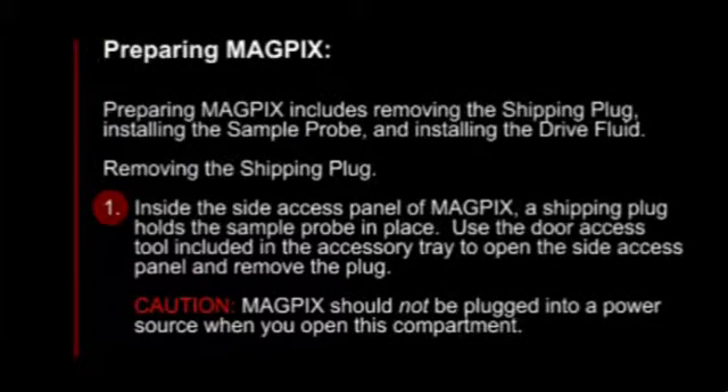Preparing MagPix includes removing the shipping plug, installing the sample probe, and installing the drive fluid.